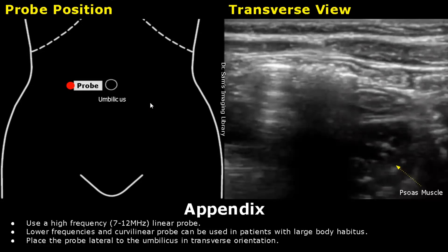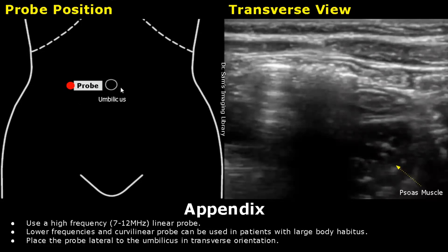The appendix has a variable location in the right lower quadrant. Use a high frequency linear probe with a frequency between 7 to 12 megahertz. In patients with a larger body habitus, use lower frequencies and you can even use a curvilinear probe. You can start by placing the probe lateral to the umbilicus in transverse orientation.